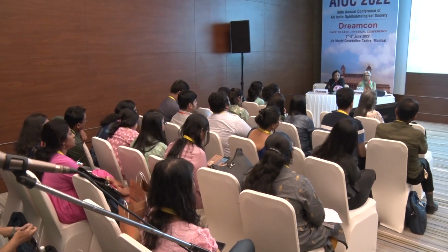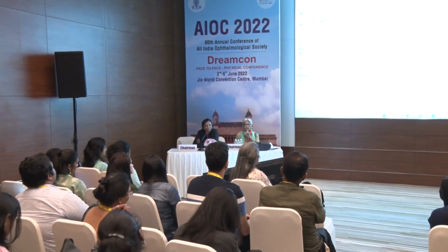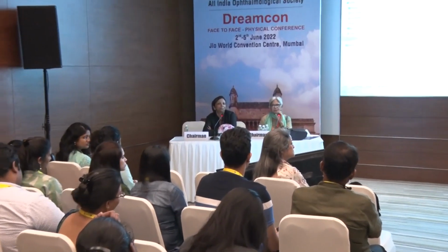What do you all use? Which tonometers do you all use? Hands up for applanation. Okay. In which patients are you not able to use the applanation tonometer? Kids? Scarred corneas? And? Edematous corneas you can use, but the reading comes low. And?